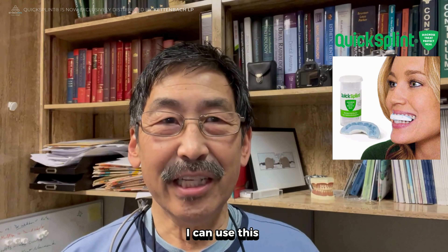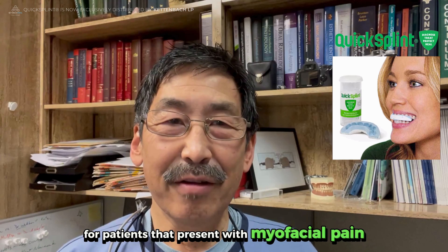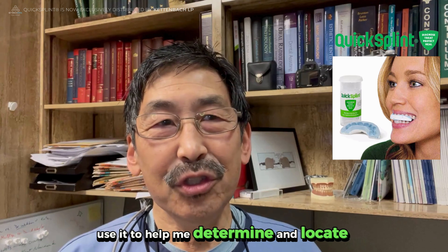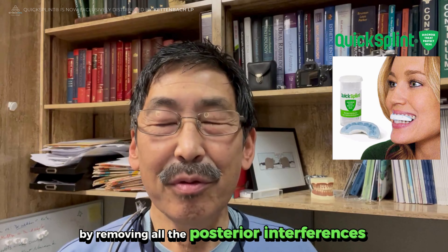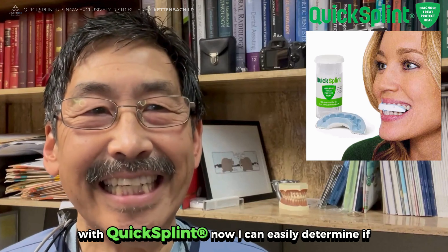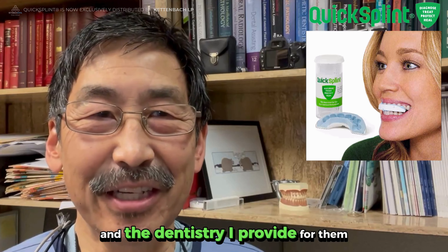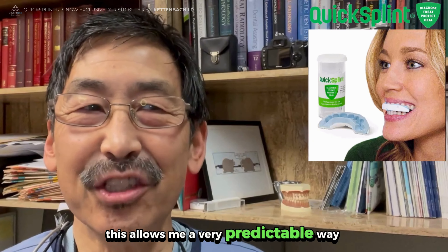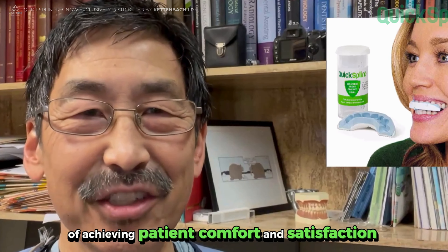The wonderful thing is I can use this as an immediate temporary splint for patients that present with myofascial pain, and as well as use it to help me determine and locate the most orthopedically stable joint position by removing all the posterior interferences on the back teeth. With Quick Splint, I can easily determine if I can control the forces that threaten my patients and the dentistry I provide for them. This allows me a very predictable way of achieving patient comfort and satisfaction.